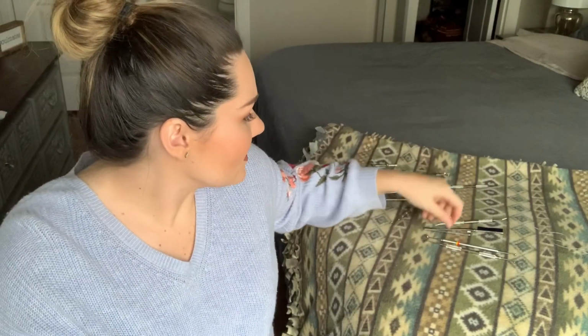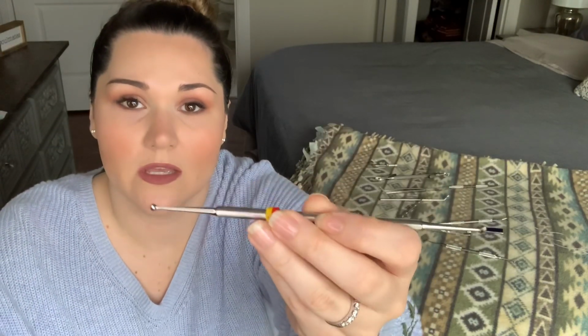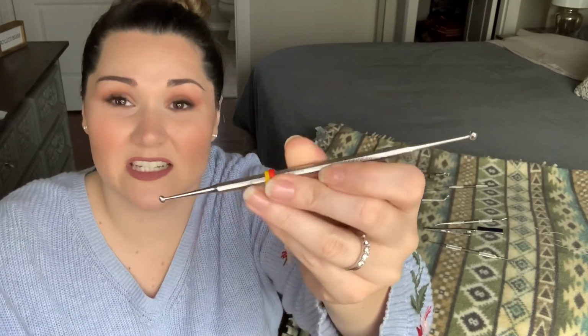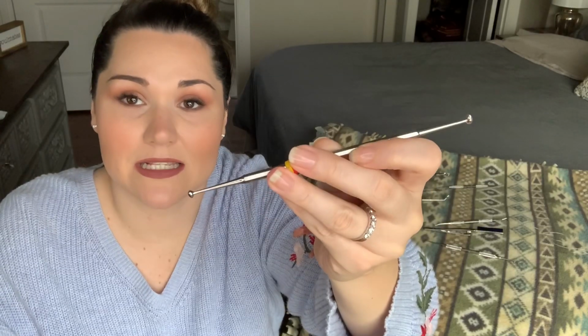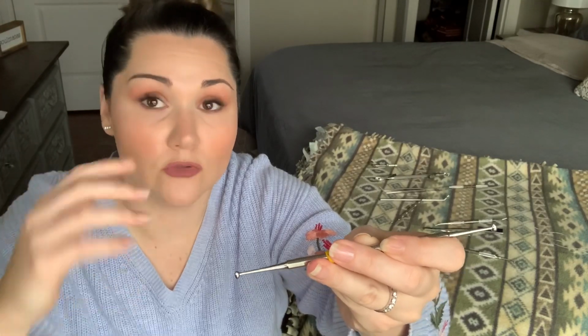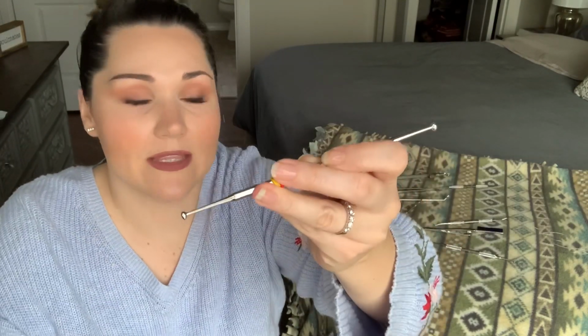The next instrument my dentist likes is this football burnisher. So he uses this to kind of smooth and push in the amalgam some more. Some dentists will use the ball burnisher, but my dentist likes this, so he uses this to kind of smooth and push in. You want to make sure you have your suction in there to catch any excess amalgam that may fall. Your large suction. So you're doing that.